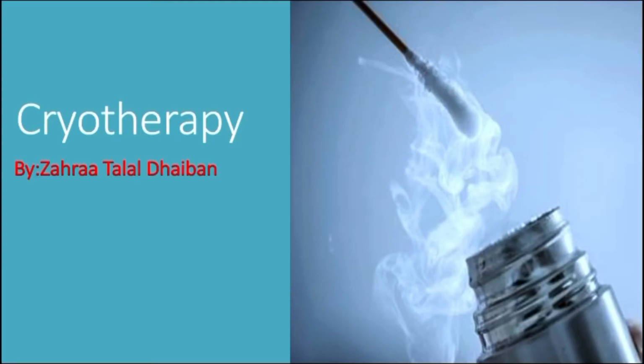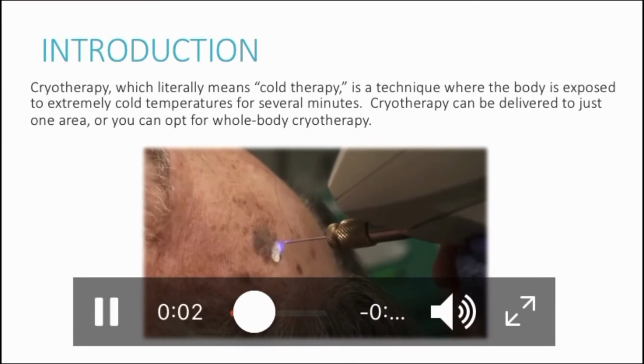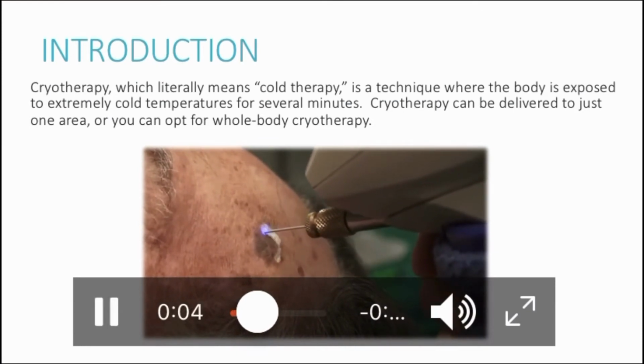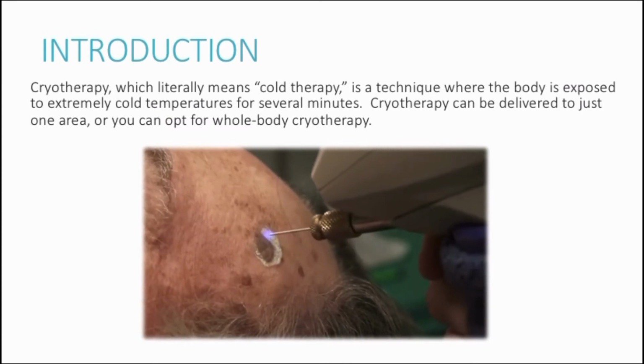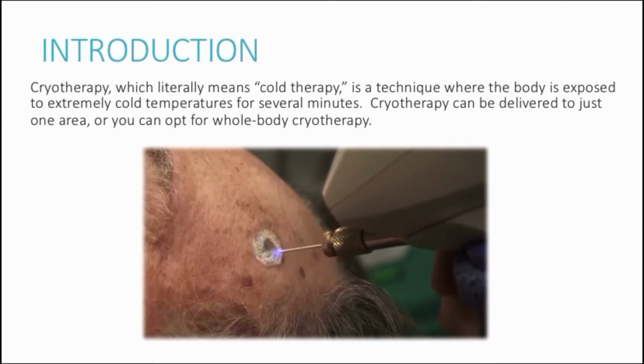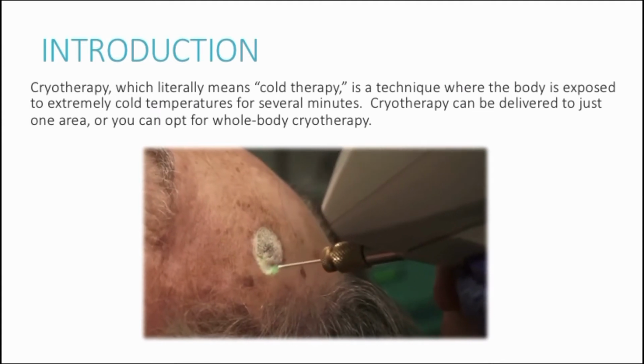Hello, I am Zahraa Talal and I will discuss the second part of our seminar, cryotherapy. Cryotherapy, which literally means cold therapy, is a technique where the body is exposed to extremely cold temperature for several minutes. Cryotherapy can be applied to one area or to the whole body.